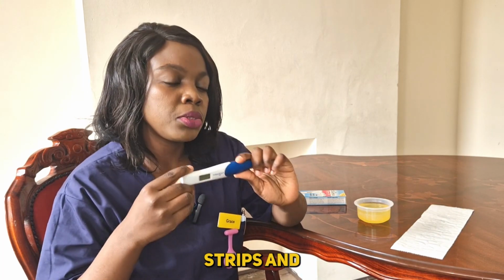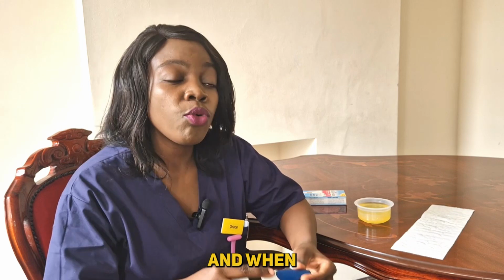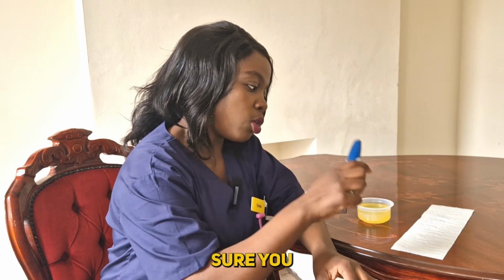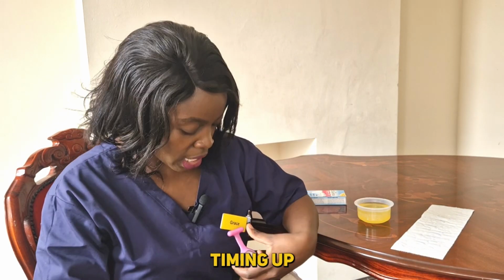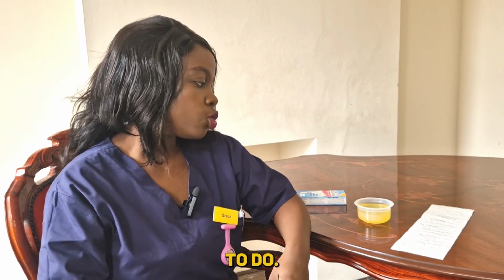But I've told you it comes in different strips and different instructions. Please make sure when you buy yours, you read the instructions that you've been given. And when they tell you it's 5 minutes, please make sure you leave it there and set your timer for 5 minutes. Leave it for 5 minutes before you check. So that is what I'm going to do.